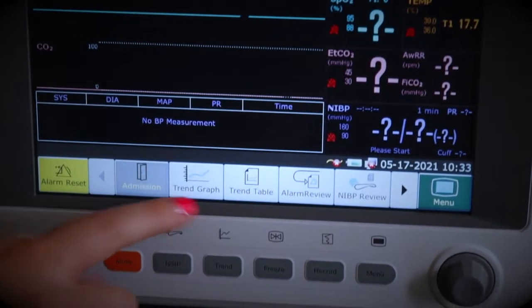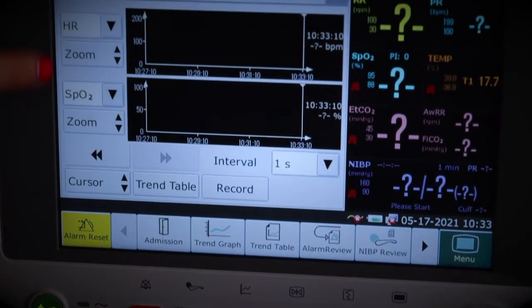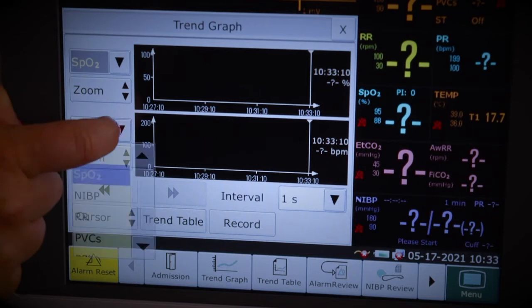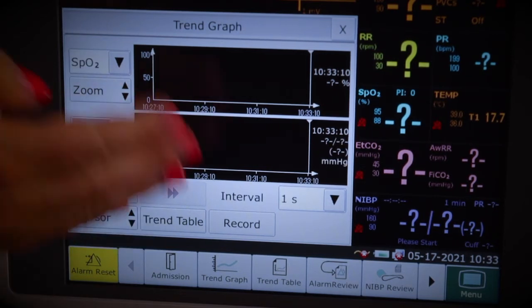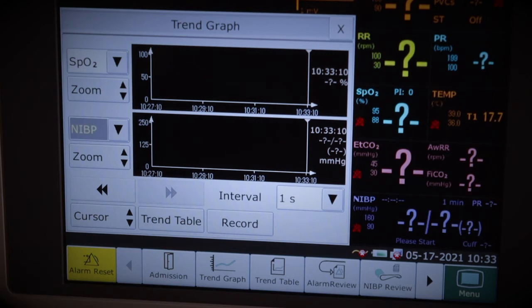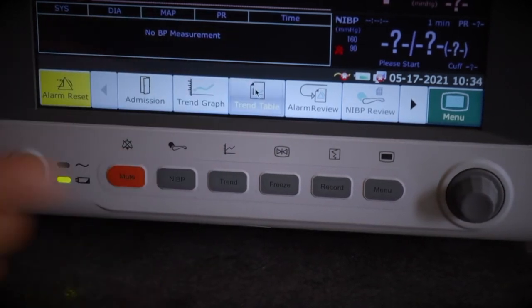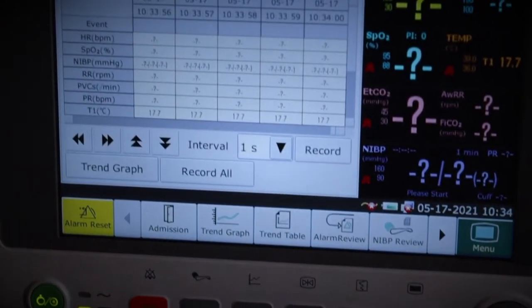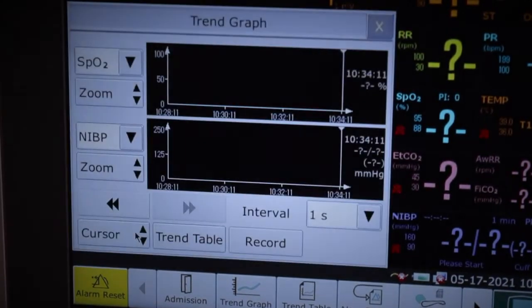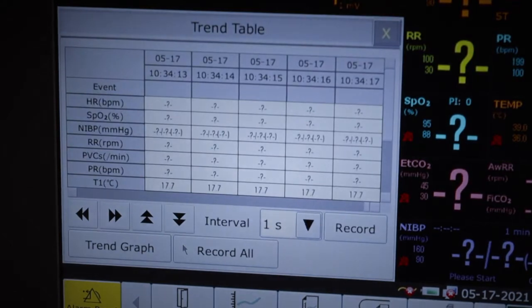The next button along is trend graph. Clicking it brings up your patient data in a graph, with drop-down menus on the left to select parameters like SpO2 or blood pressure. If you want to print at this point, hit record and it will print via a connected printer. Next to trend graph we have trend table — same premise, but data is shown in a table. You can hit record to print, or switch between trend graph and trend table using the corresponding buttons.